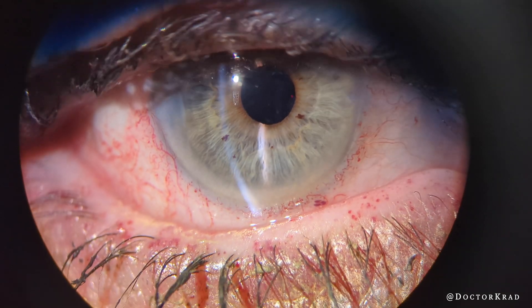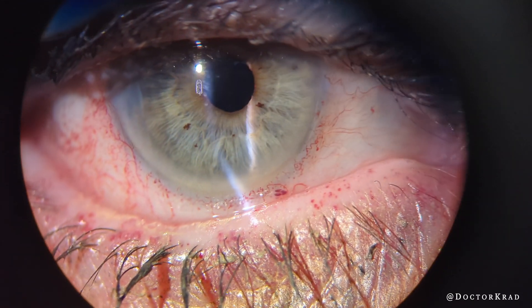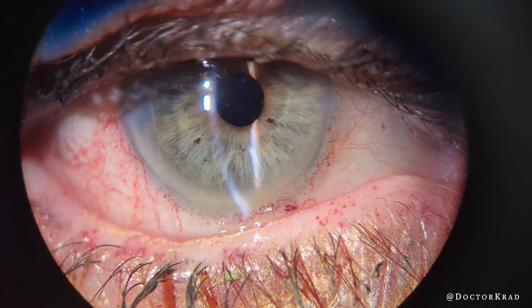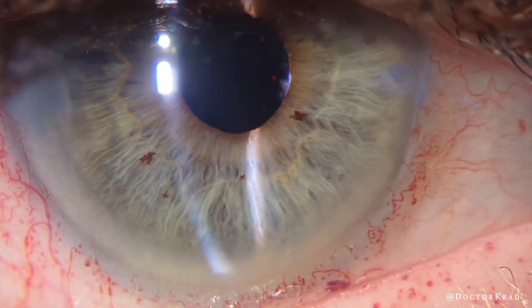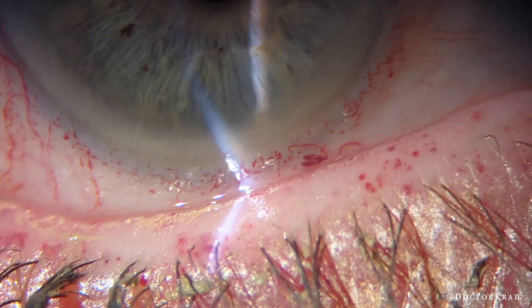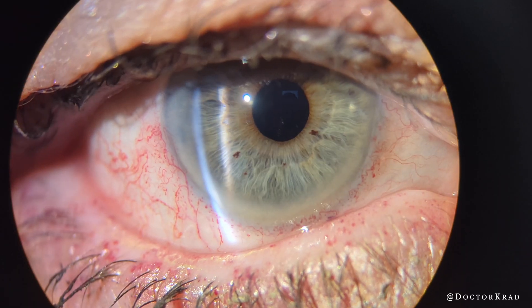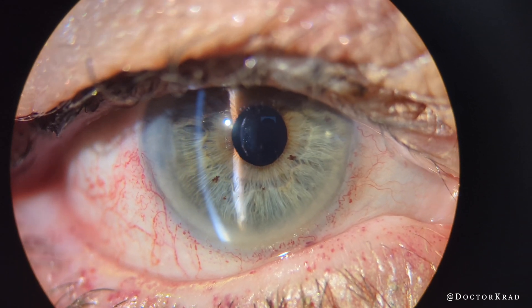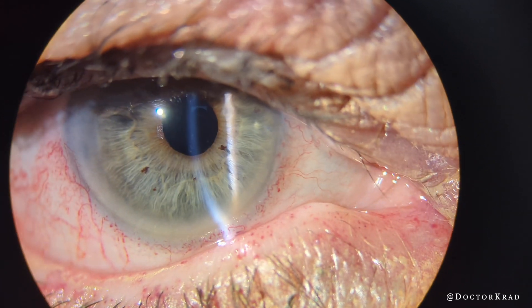Fortunately she did very well — she could see very well the first day, 20/25. You can see all these perilimbal abnormal blood vessels as well as on her lid margin. One doesn't have to clean out the AC so thoroughly, but it's very nice to see a very quiet AC in the immediate post-operative period.